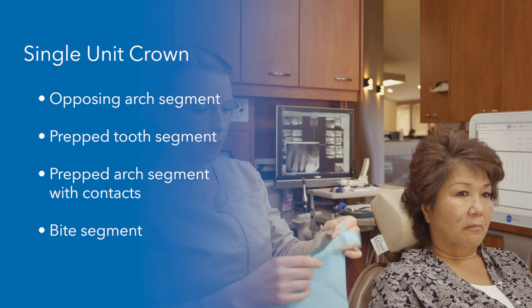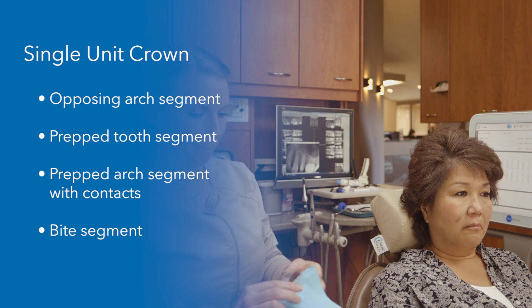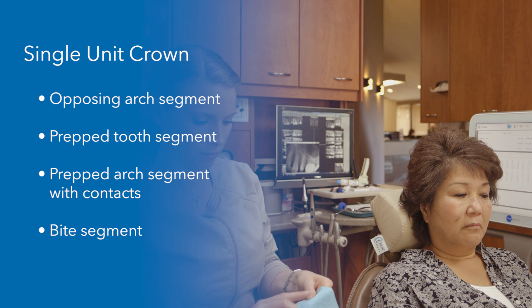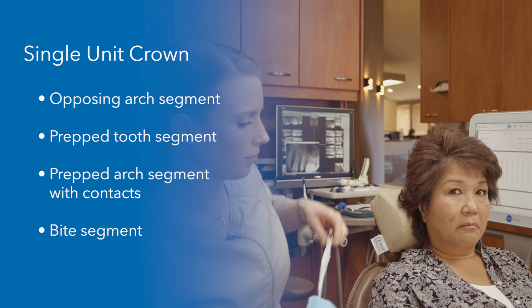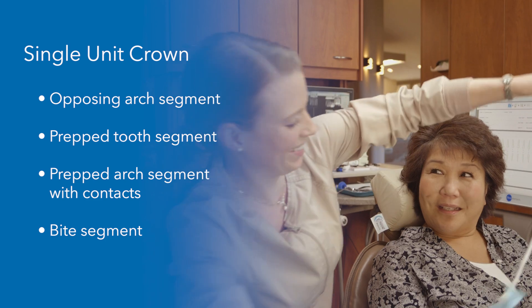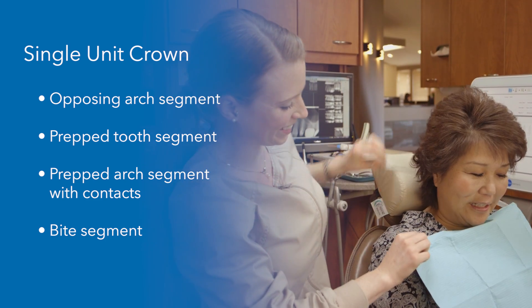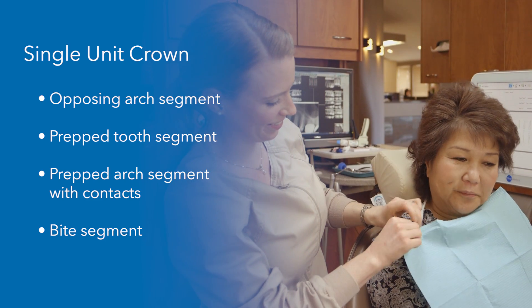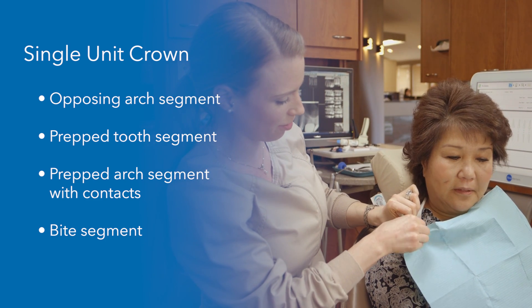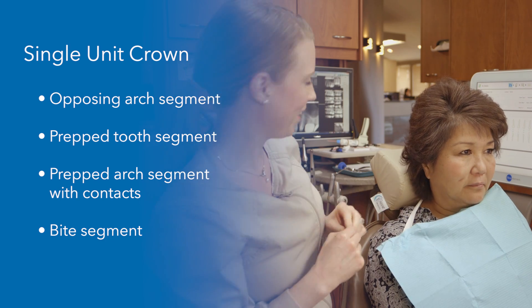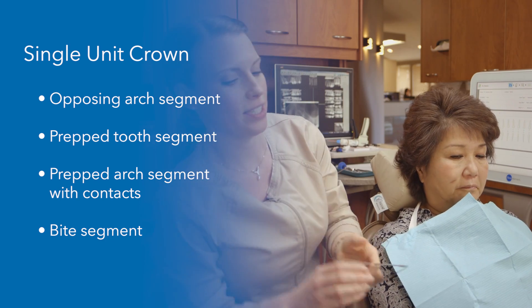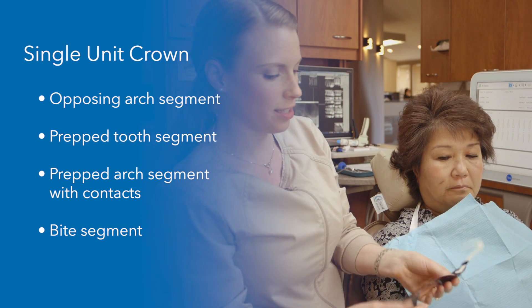I will include the anatomy from the most posterior tooth to the cuspid in the prepared quadrant. There are four recommended scan segments in the sequence for a single unit crown case: the opposing arch, the prepped tooth, the prepped arch, and the bite.